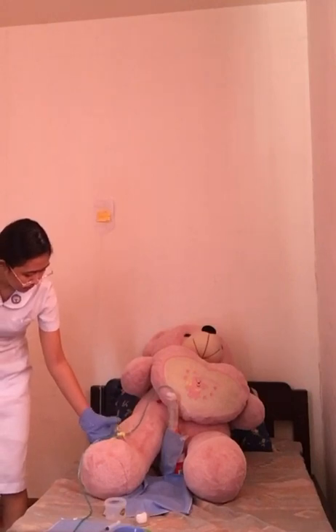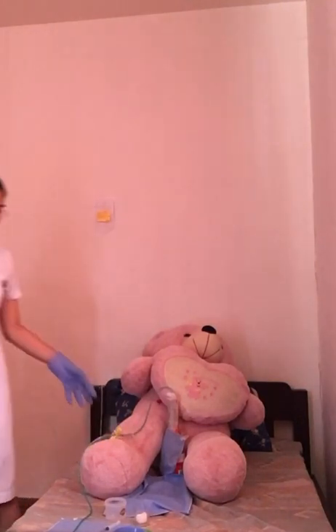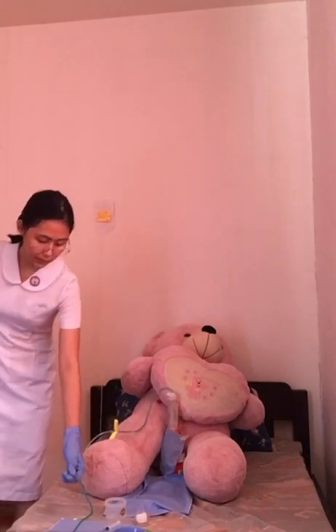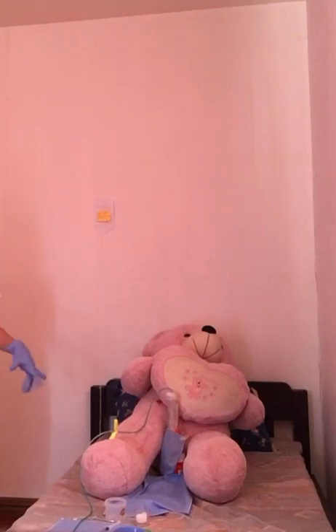We're going to clamp it. And then we unclamp our tubing, and then we will be repeating the procedure as necessary, and then we will remove our gloves.